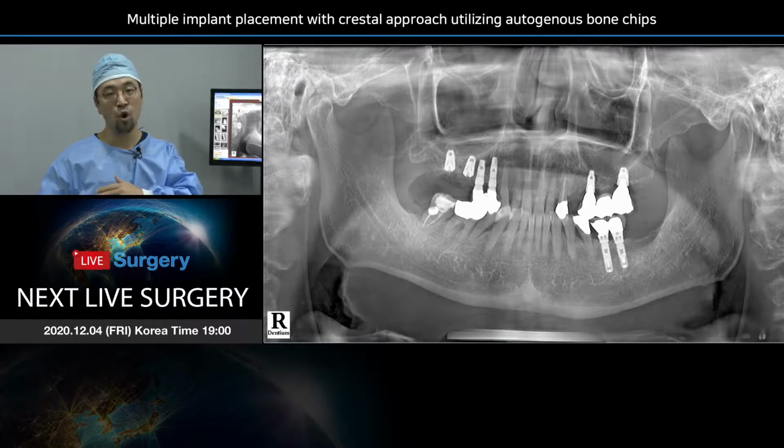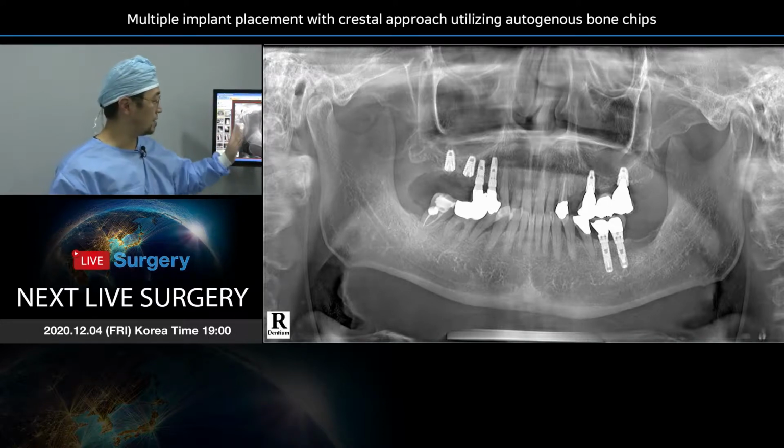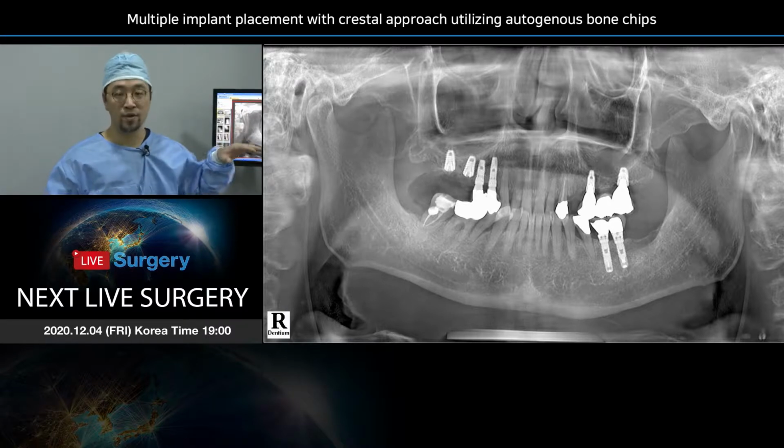As you can see, there was no bone at all at the palatal aspect, but by the mixture of the autogenous bone, which has a great healing potential, and the Osteon 3 collagen, which is the bone, but mixed with the collagen, 5 to 8%, and they are mixed together, and they stay in shape. So this is the most important thing, stability of the bone graft. On top of that, I have applied the collagen membrane to better support the stability of the bone graft.